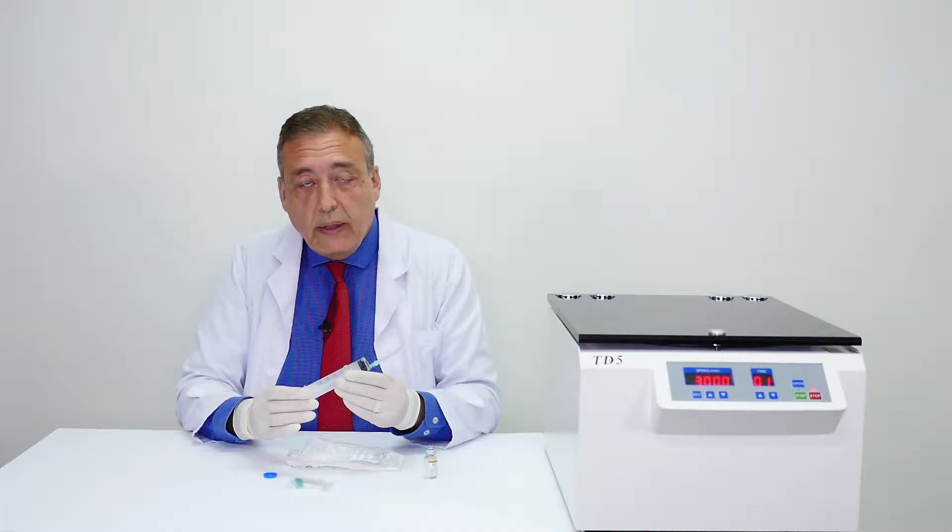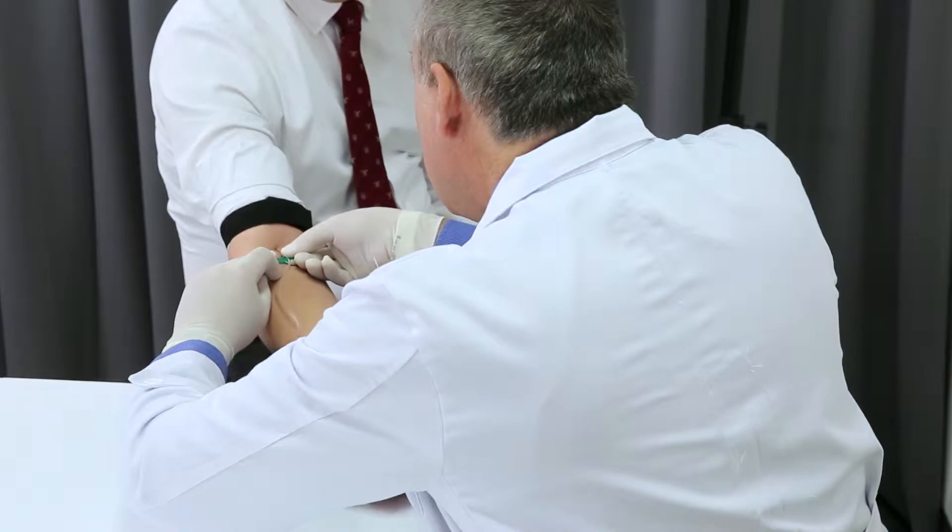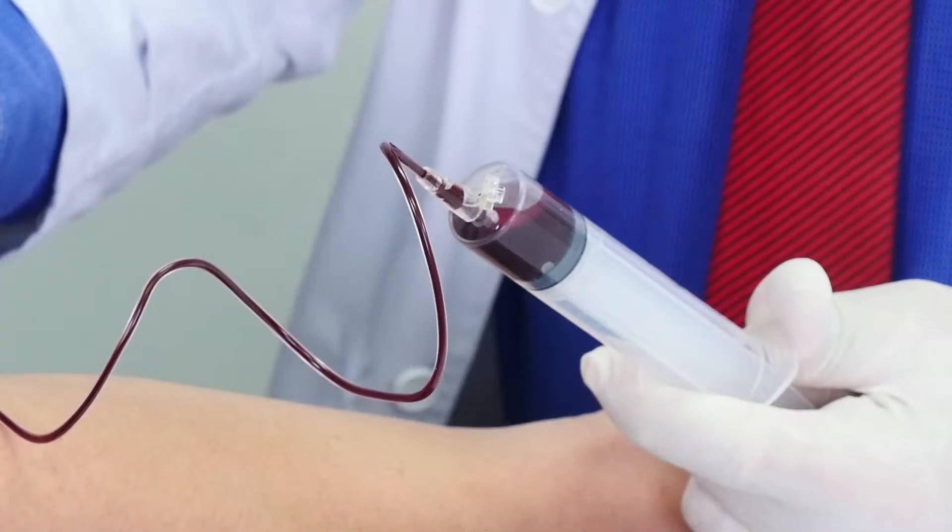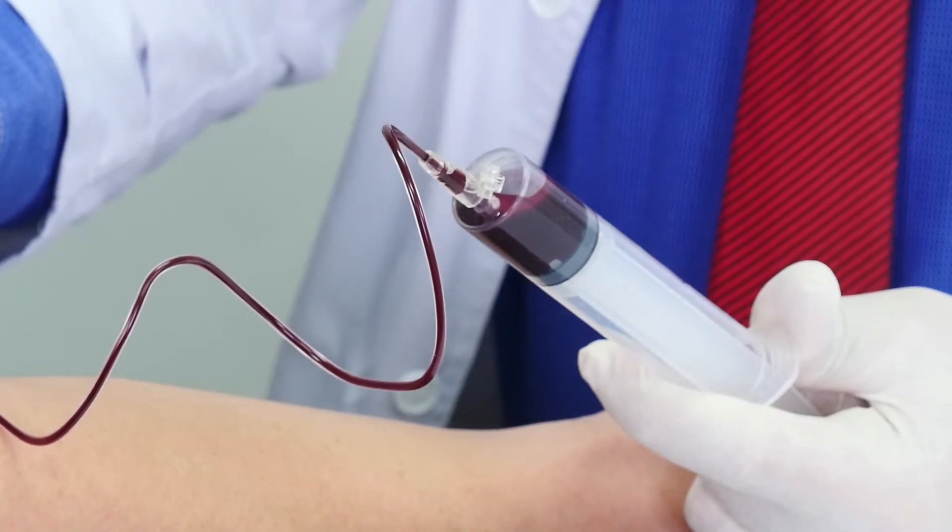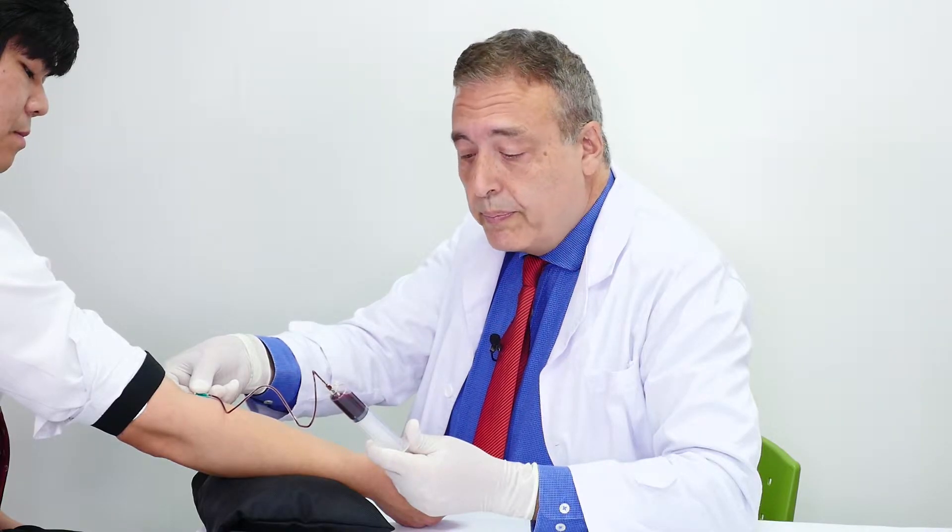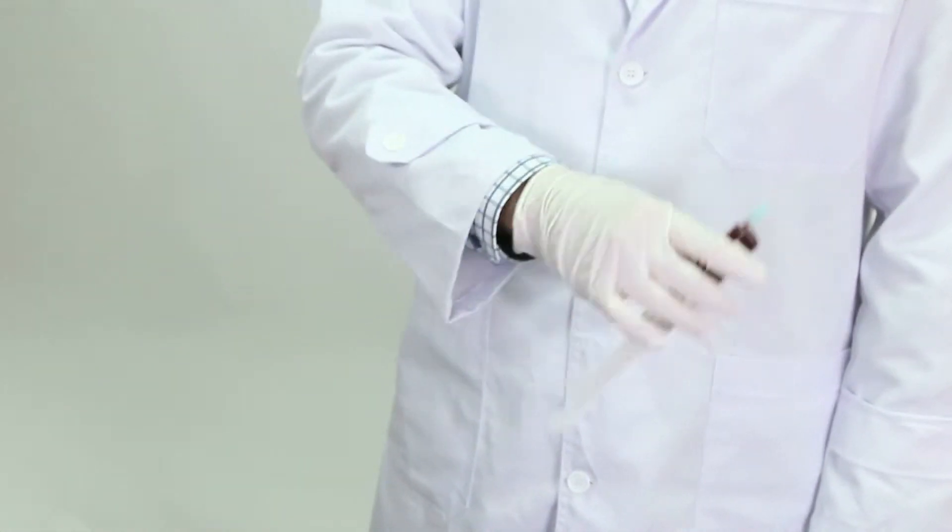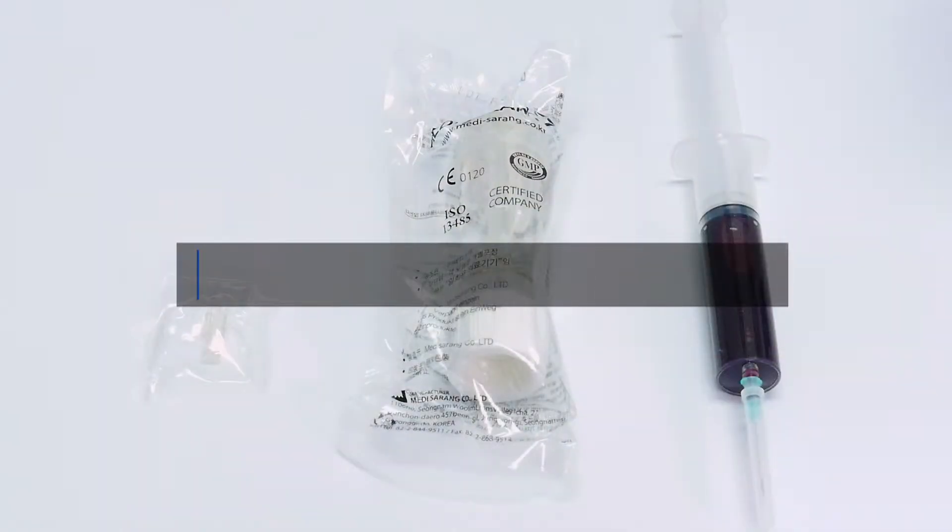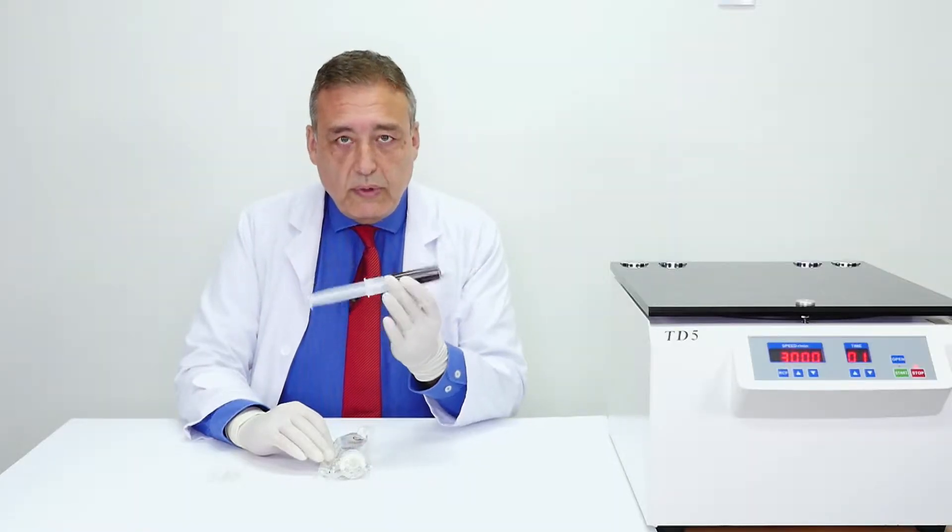We're going to connect the butterfly and draw the patient's blood. So the blood sampling is very important in order to take care of the platelets. You will notice that we aspirate very gently so that we don't harm them.